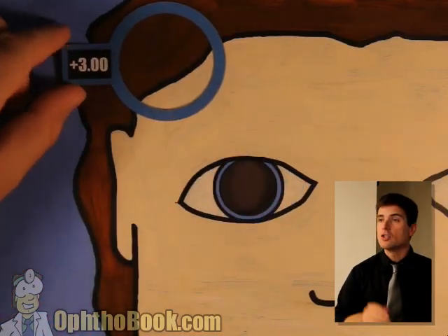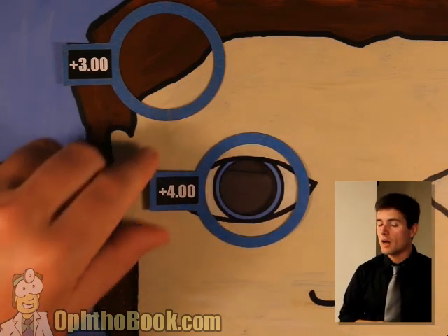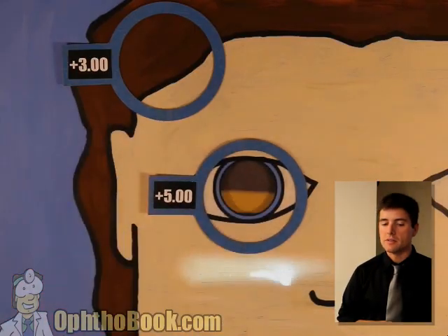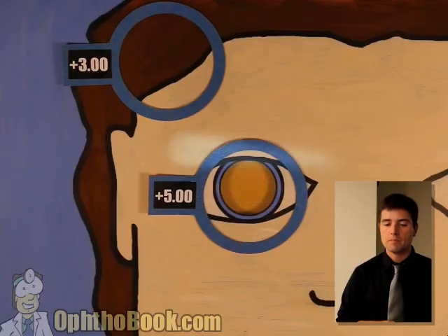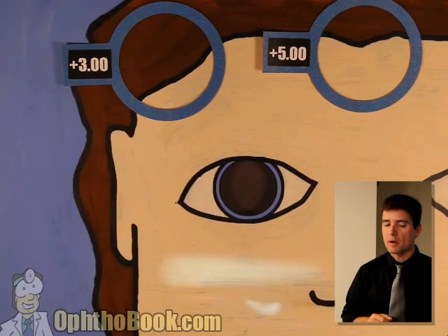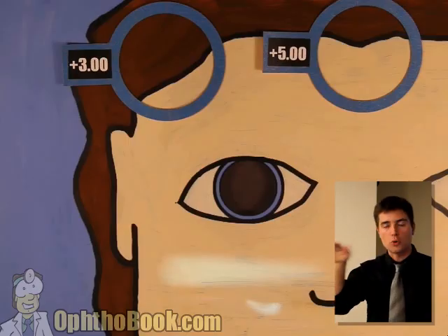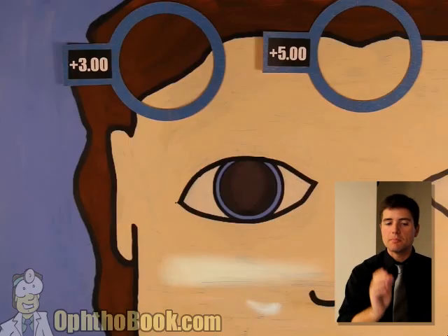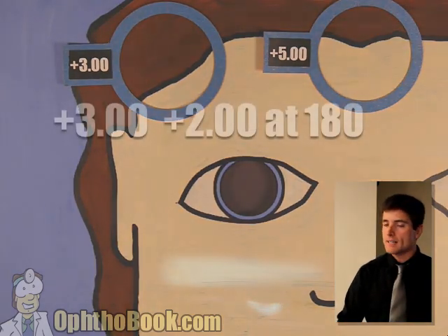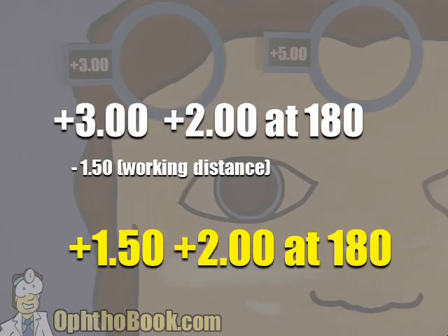Set it aside or you'll forget. Keep adding power and go back to the other direction until we fix that too. Still have width, not quite there yet. Let's try this plus five lens. Perfect — now we have the right power for that meridian. Set the lenses aside. This prescription is a plus three plus two — it's the difference between them. The axis: we can just look at where our light beam is oriented right now. It's going sort of horizontal, so the axis is at 180. The answer is a plus three, plus two at 180. Write it down. Subtract your working distance, and our final prescription is a plus 1.50, plus two at 180.